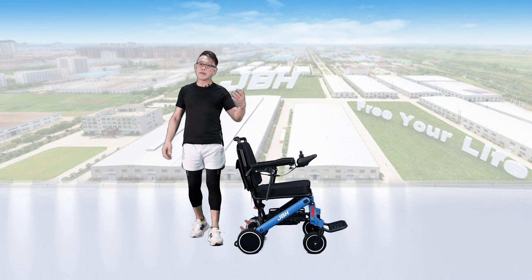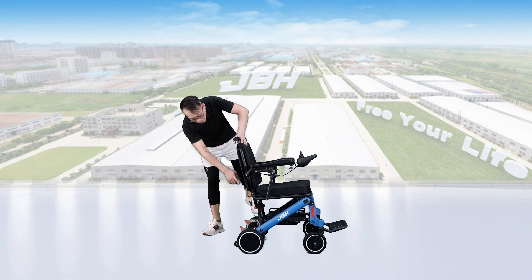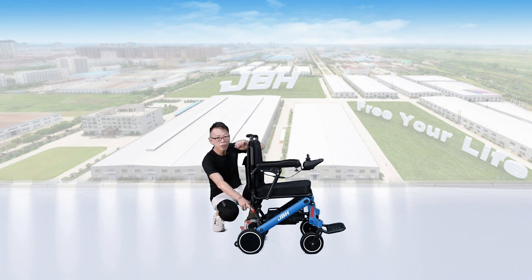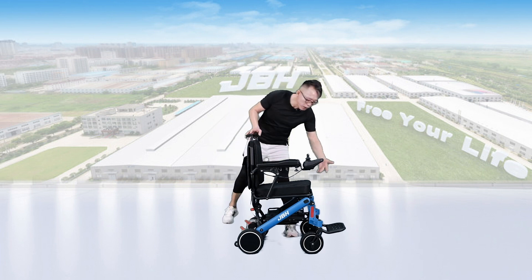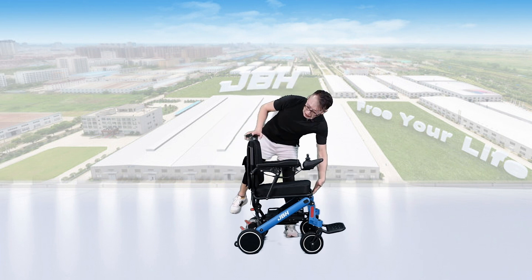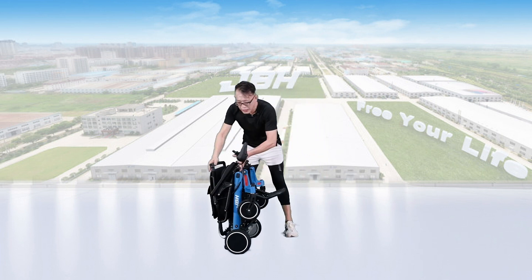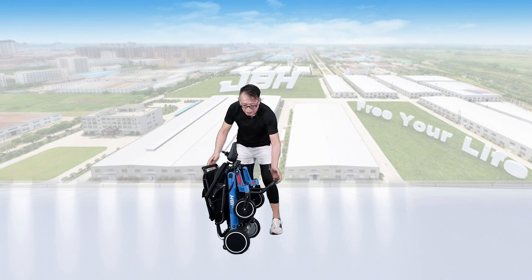Folding the wheelchair is also very simple and easy. Find the folding mechanism with the red button on the back — push it down, then push the seat back forward a little bit. Then hold the seat base with one hand and the top of the seat back with the other, and push both hands toward the center. You can fold the wheelchair in one second.